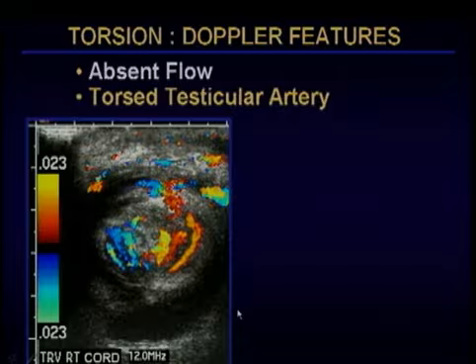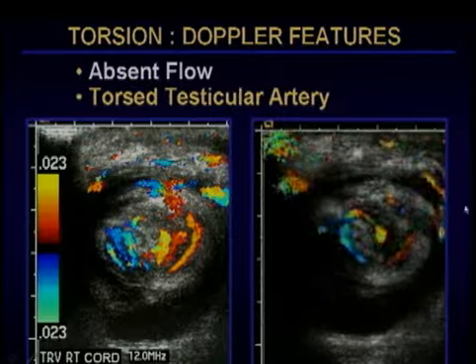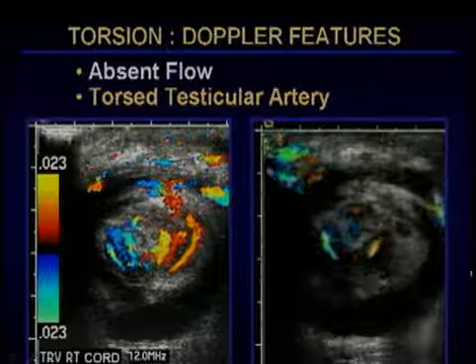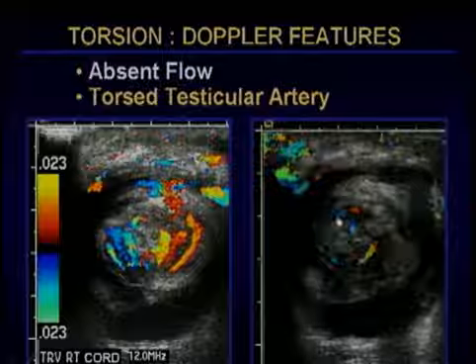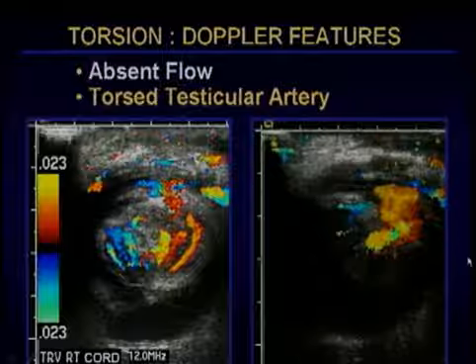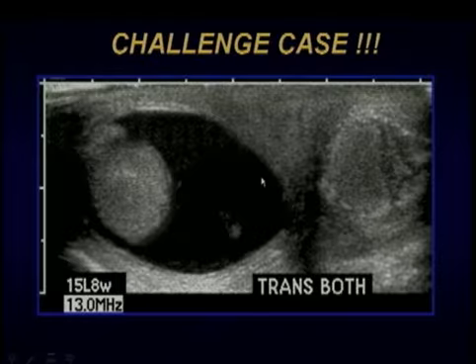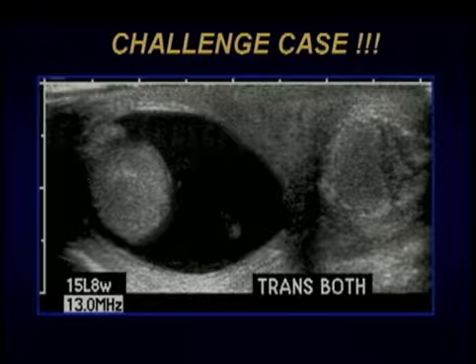If you're entertaining the diagnosis, similar to what we do in women, looking for the so-called whirlpool sign or twisted area where the ligament leads into the ovary, looking for the twist, you can do the same thing in a man. You come up at the inguinal level, and you can see, this case was done by my colleague when I worked at the Brigham Hospital in Boston. This was done by Rusty Brown. You can see a whirlpool sign here, or a twisting of the testicular artery. And there we have a case of a viable but torsed inguinal testicular artery at the level of the inguinal canal.